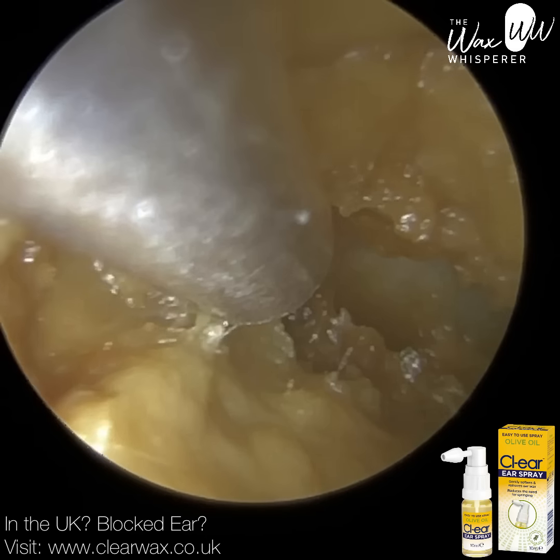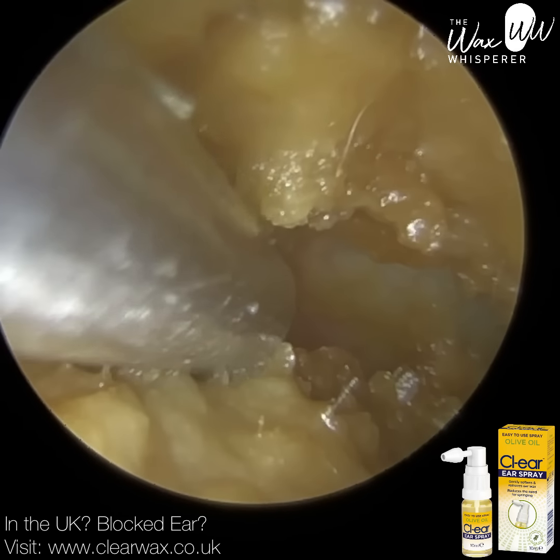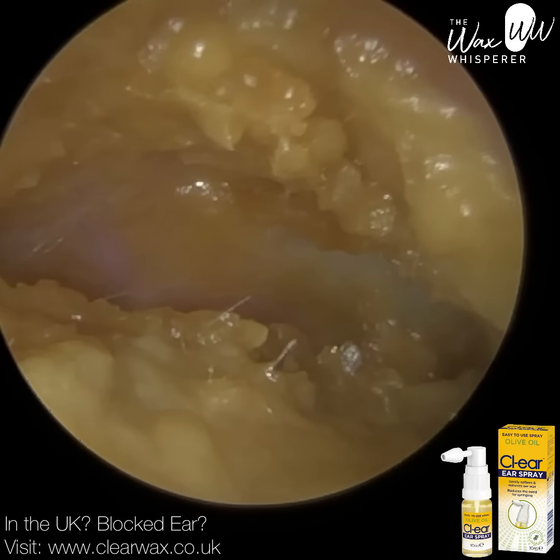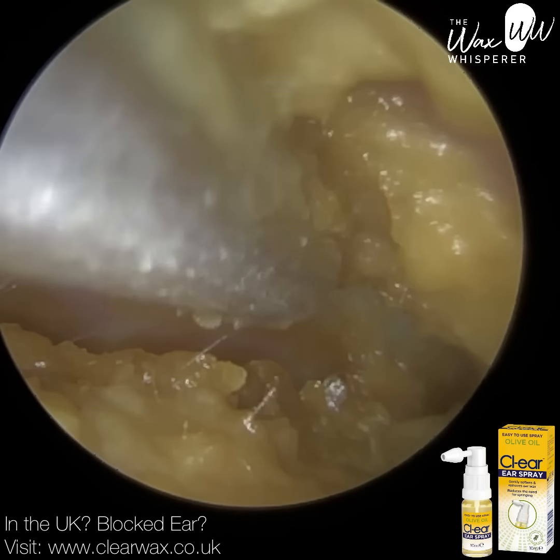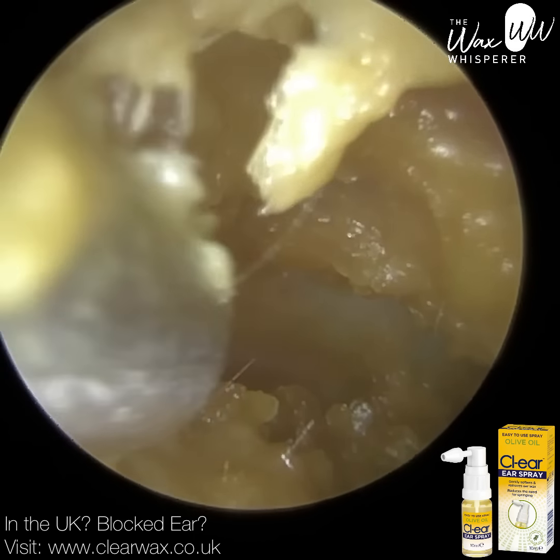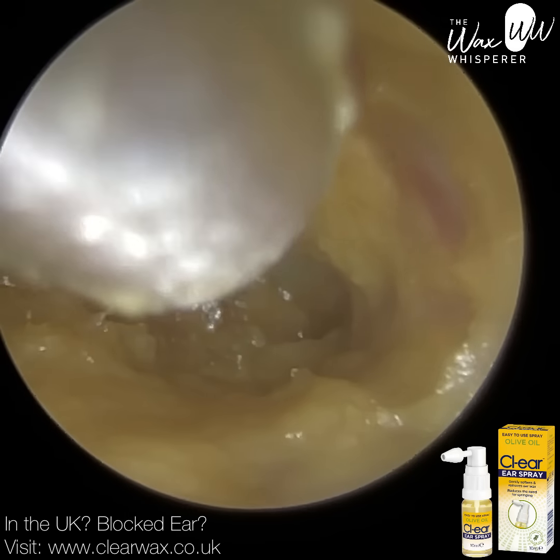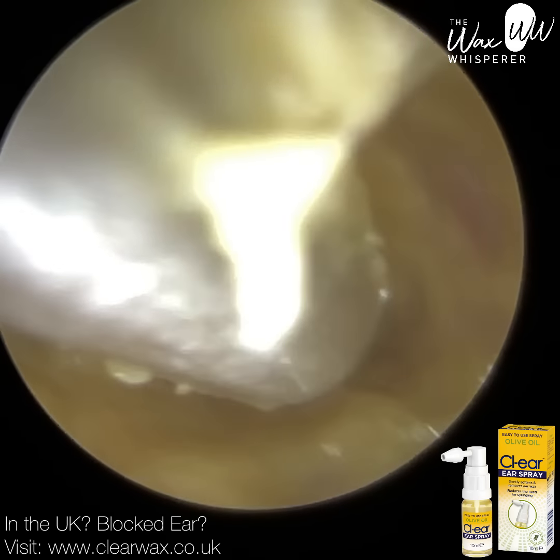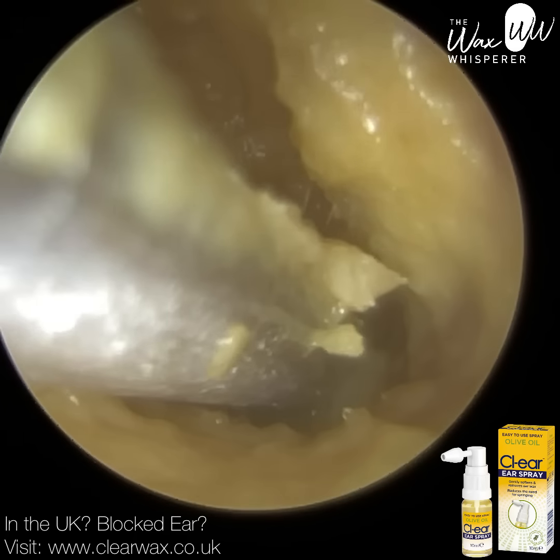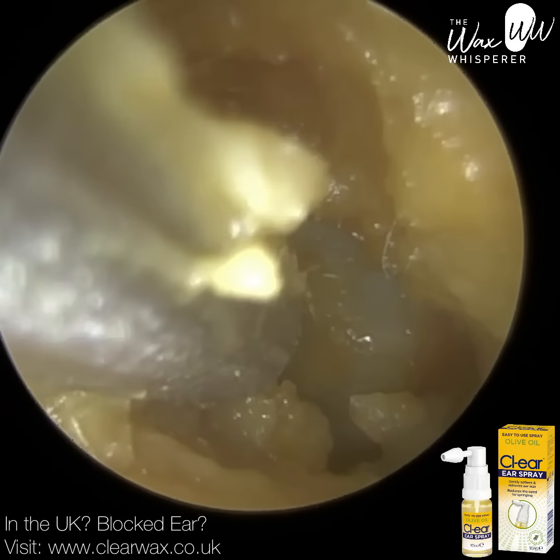And the outer third of the ear canal is made up of cartilage and a thick layer of skin, about a millimeter in thickness, and then around a centimeter into the ear canal, so after the first third, the inner 2/3, the ear canal is then made up of bone, and the bone is covered by a very thin layer of skin, which is less than, probably about 0.1 millimeters in thickness, about 1/10 of the skin that lines the outer cartilaginous portion of the ear canal.